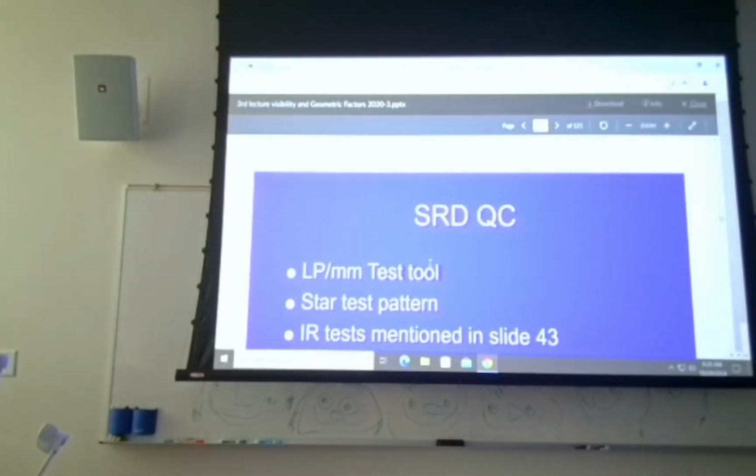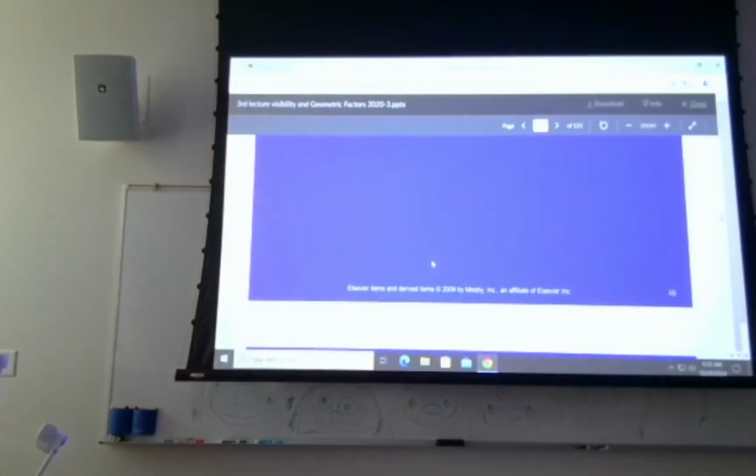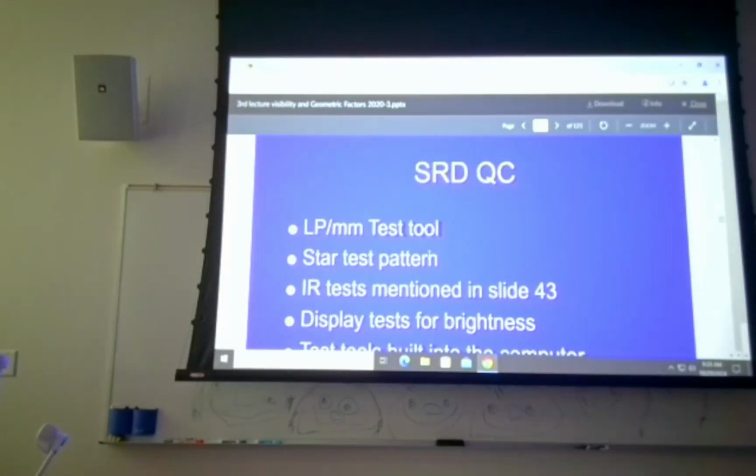CR and DR systems. We kind of talked about that as well last week, and that is that what we have, just like on your computer, your sharpness on your computer or your television is controlled by two things. They're interconnected, but it's two things. Be it the DR plate or the display, you got two things, right? You got a matrix. Right, so the matrix just describes the number of individual pieces that you have. Right, so matrix is the overall thing. That's that 1020 by whatever, 1020 by 1070 or whatever.